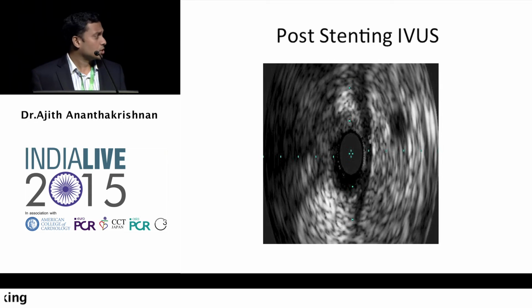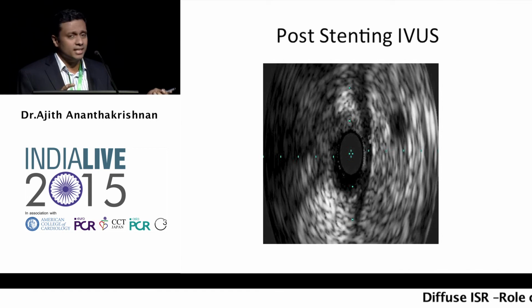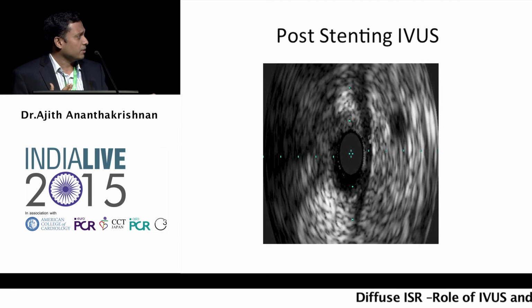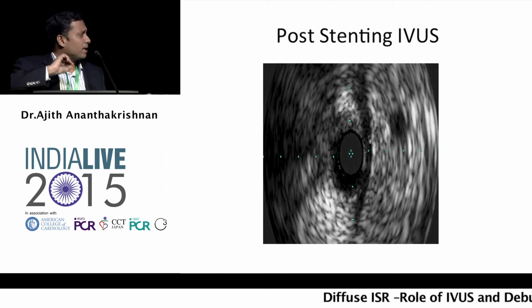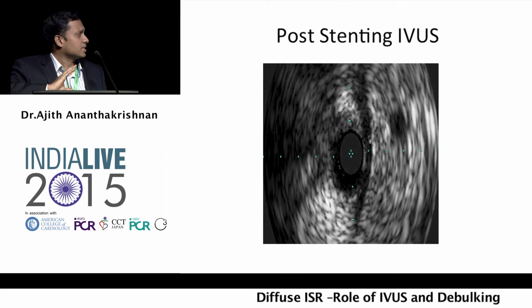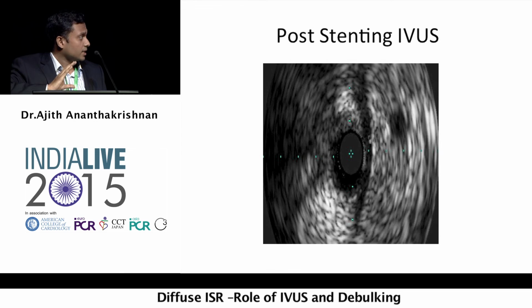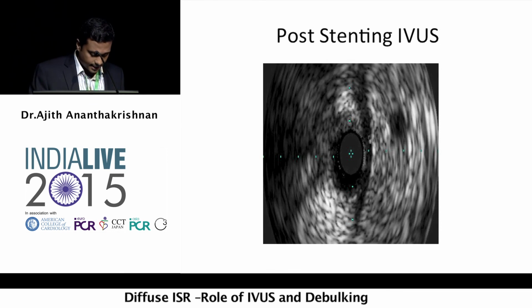Post-stenting, IVUS showed that there is significant lumen gain. That's the beauty of this imaging-guided ISR PCI. We saw that it was a 2.75 wall-hugging lumen. Now we see that it's significantly expanded. Distally 2.75, coming back to 3, and then 3.5 to 4 in the ostial LAD. I mean, we can see that there is a little bit of plaque-induced malapposition at this point, but the lumen surface area was significantly appealing. So this was after 3.5 and 4 NC balloon dilatations, and the left main stent also looked nice.